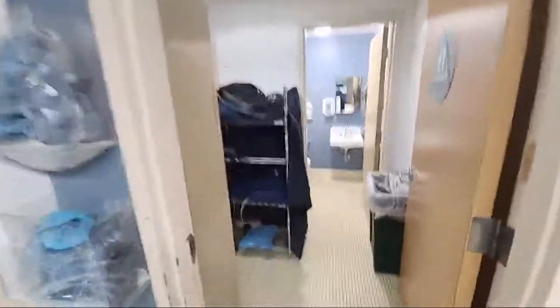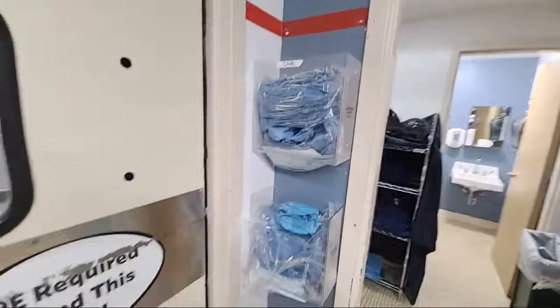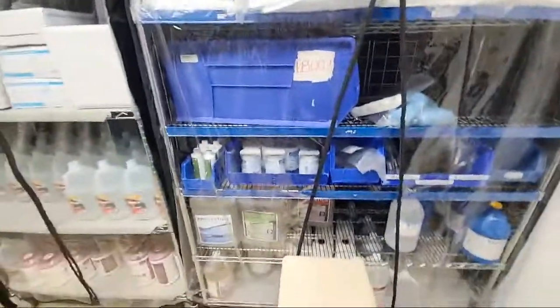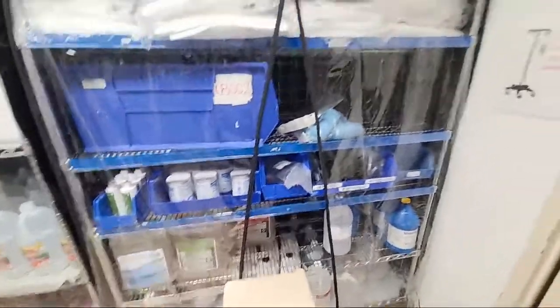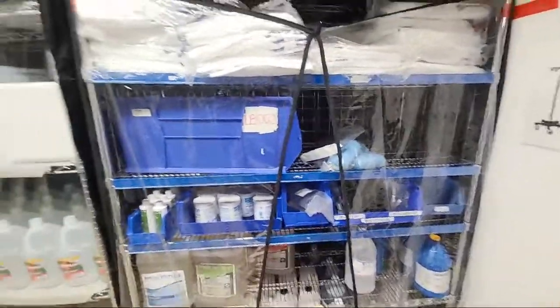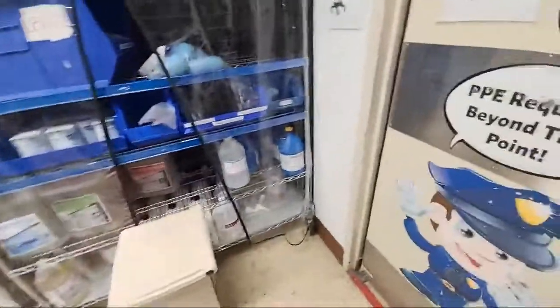That's our little locker room, little private bathroom, little seating area. We kind of squeeze in there for lunch sometimes. Shoe covers, bouffants, everything else you want over here in the decon. All kinds of enzymatic detergents, more shoe covers, face shields, gloves, distilled water, etc. Here we go, into here.